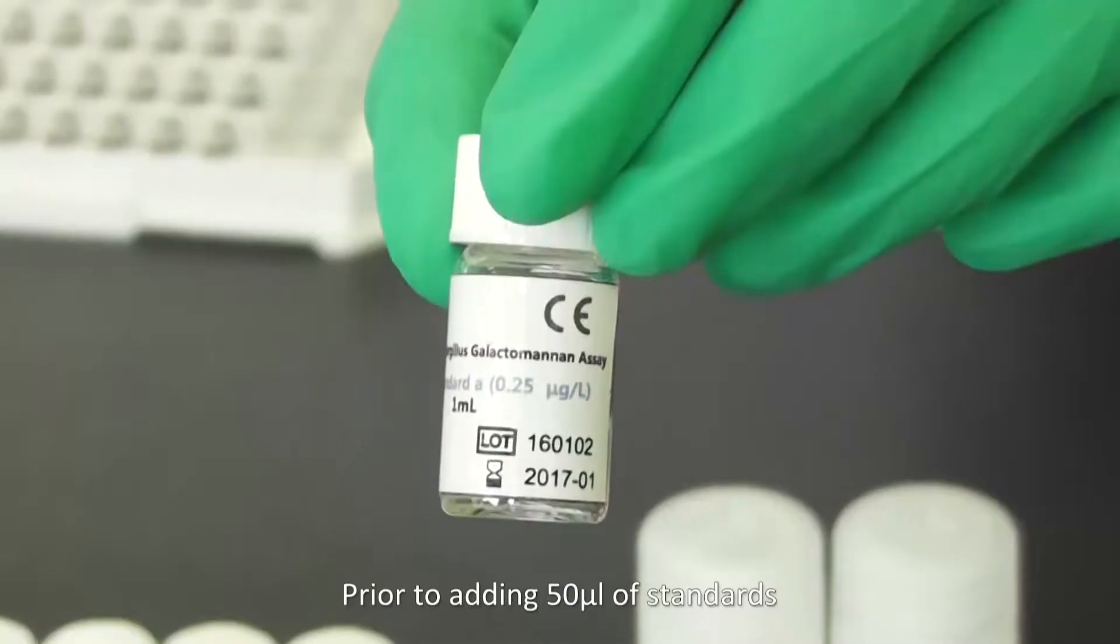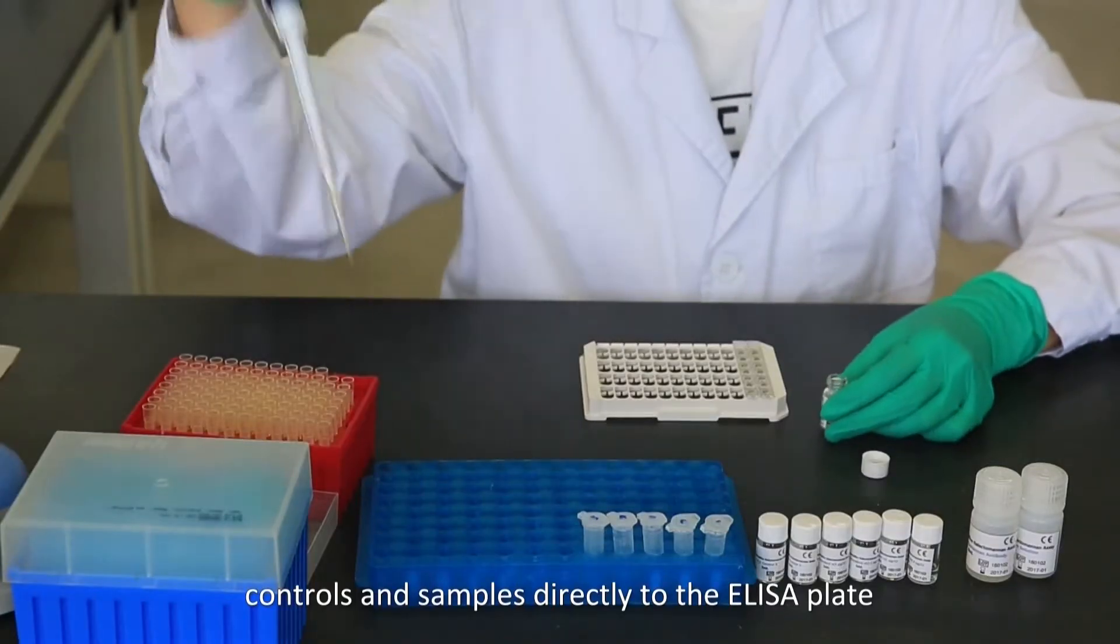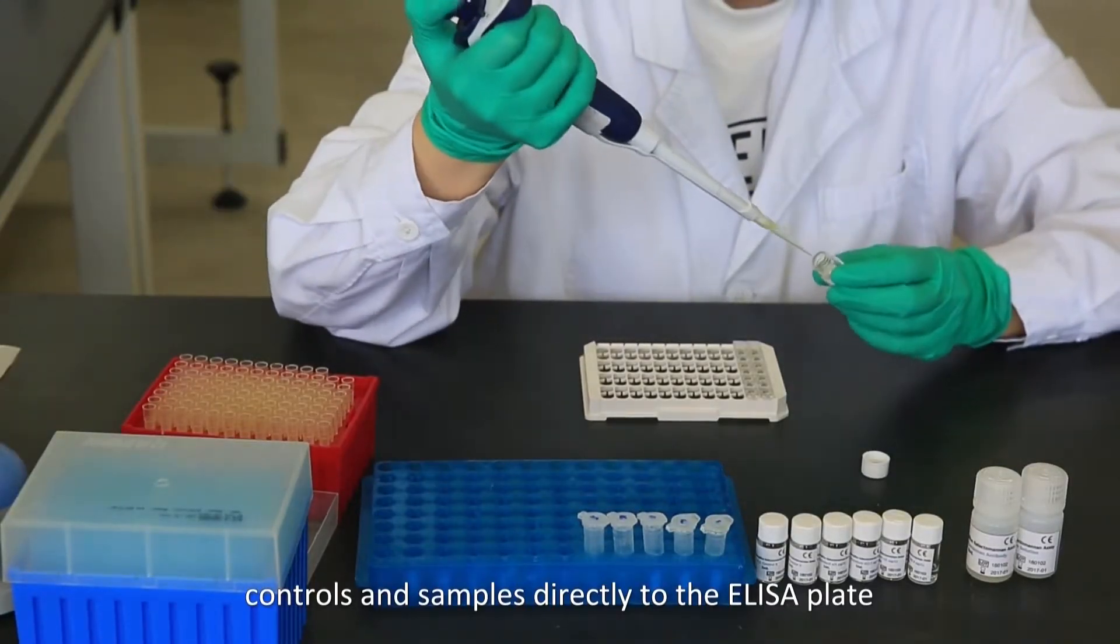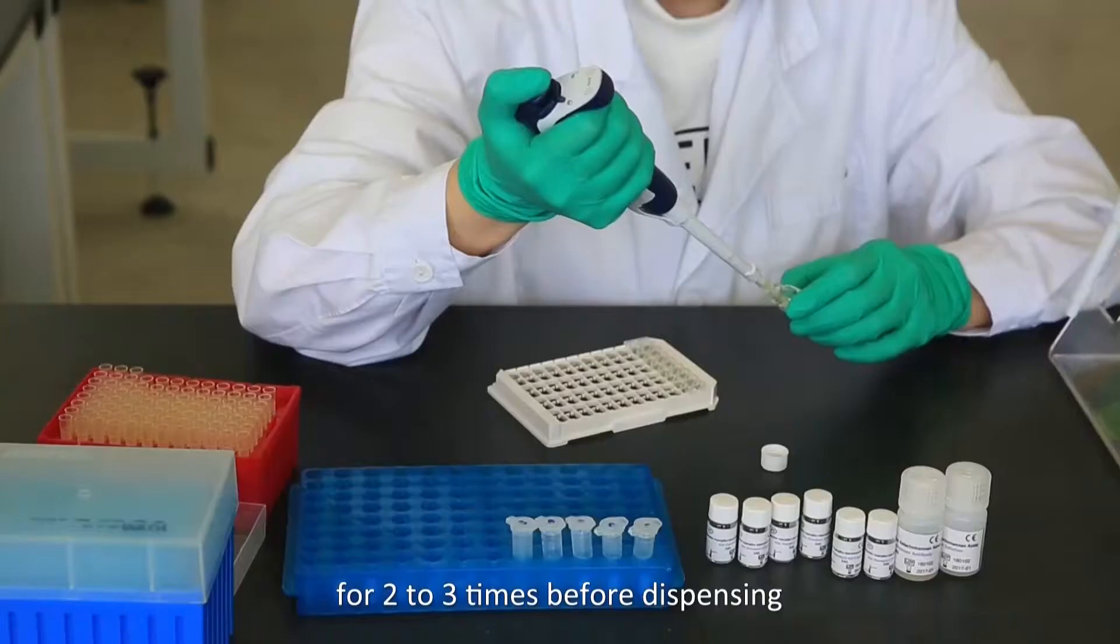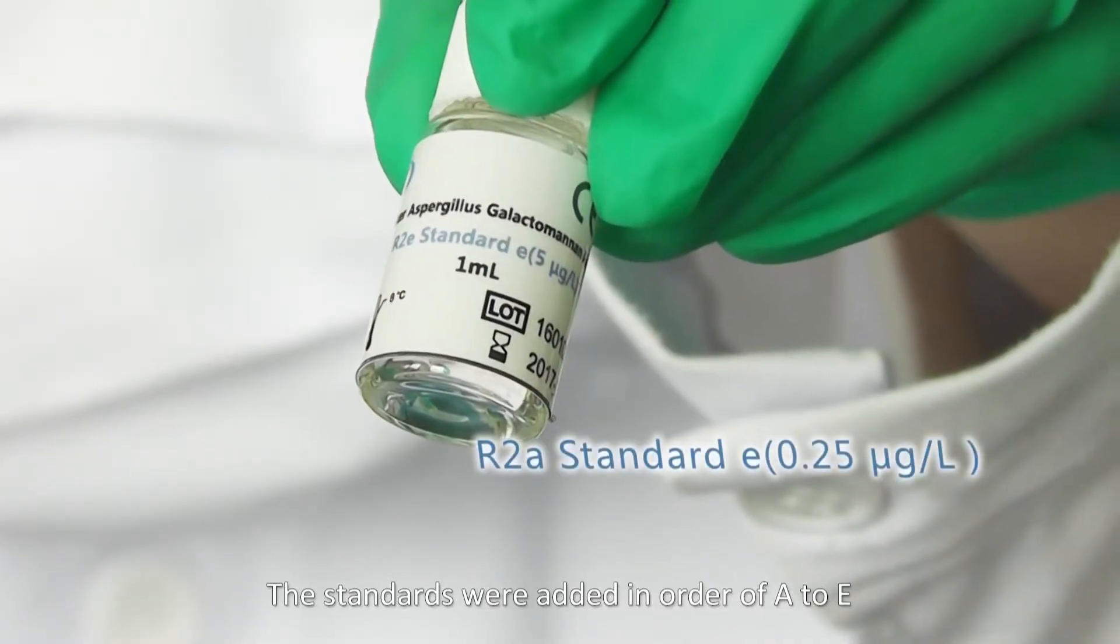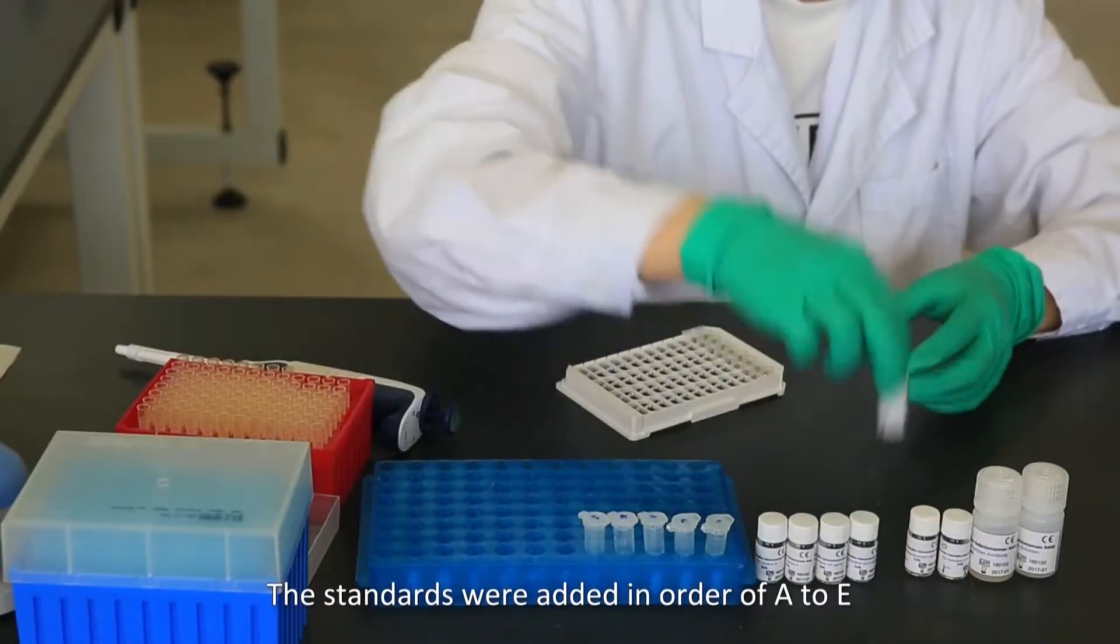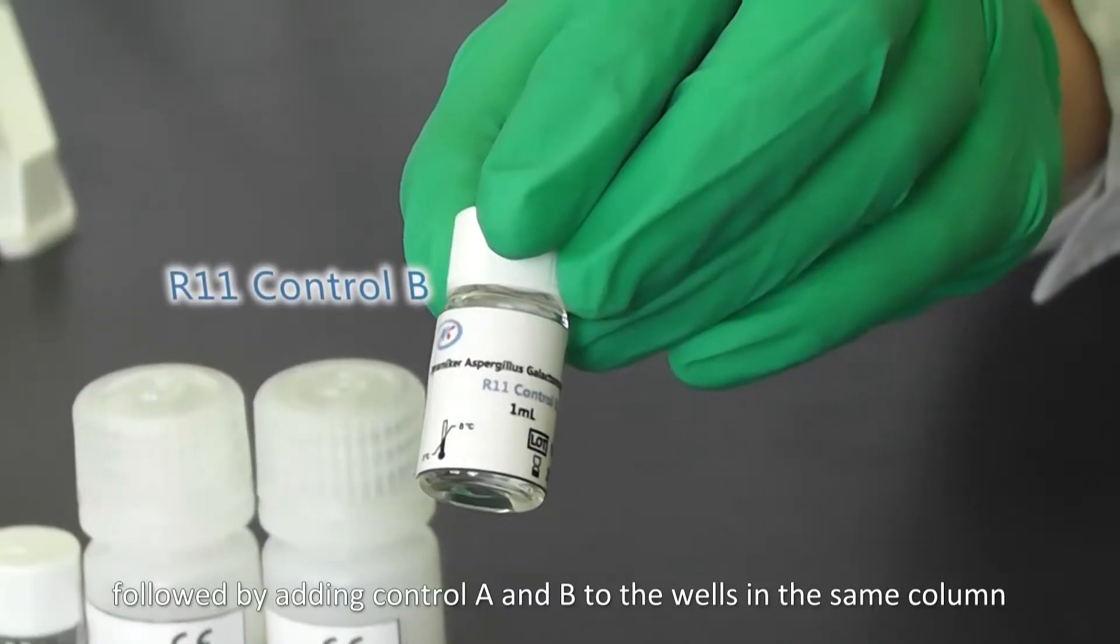Prior to adding 50 microliters of standard controls or samples directly to the ELISA plate, rinse the pipette tips with the corresponding reagents for 2-3 times before dispensing. The standards were added in order of A to E, followed by adding control A and B to the wells in the same column.